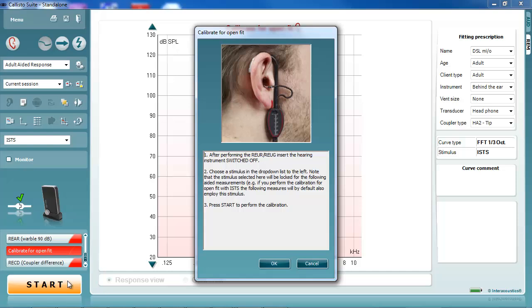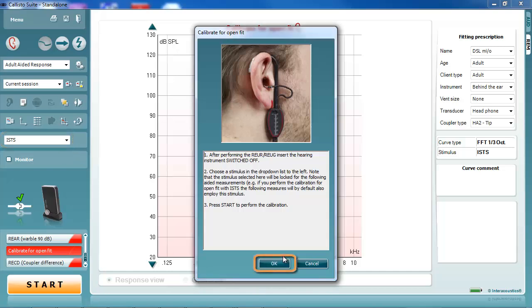Insert the hearing aid into the ear along with the probe tube. Ensure the hearing aid is switched off. Choose the stimulus which you wish to verify the amplification with. Press OK.